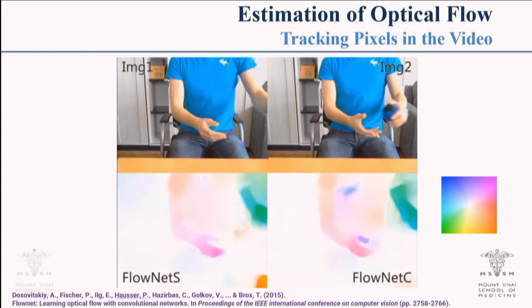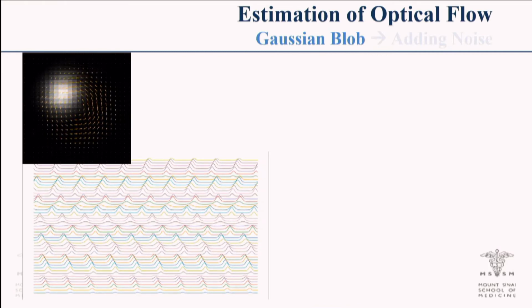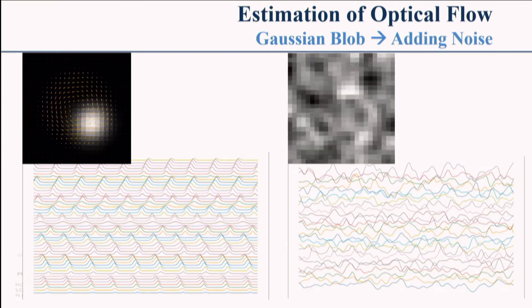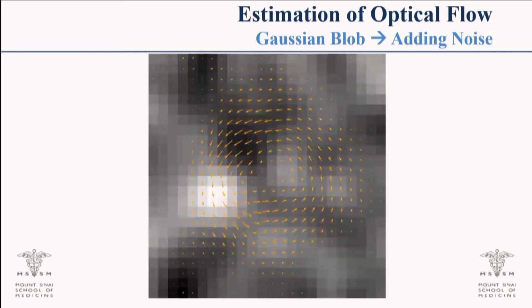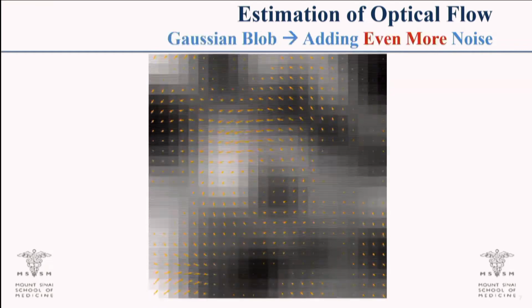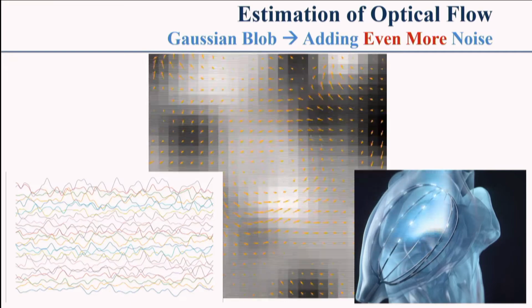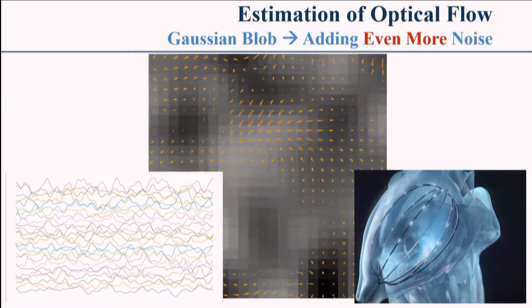So there are strategies that have been perfected for trying to estimate optical flow. Here's an example. Look at this blob that's going round and round in a circle. This is pretty easy to identify. It's not terribly complex. But let's add some noise. You can just make out a rotation in the center if you add this noise. And this is what the optical flow algorithms are able to do. They look at the different vectors of flow, and based on that, identify areas where you may have rotational sources. Here you add even more noise, and still you're able to identify this. So you can imagine that using this kind of methodology with EKGs, perhaps we may be able to identify sources amidst the rest of the noise of atrial fibrillation. At least that's the theory.